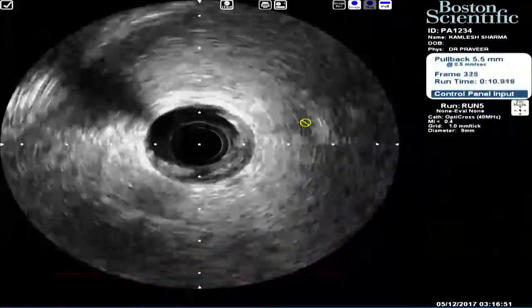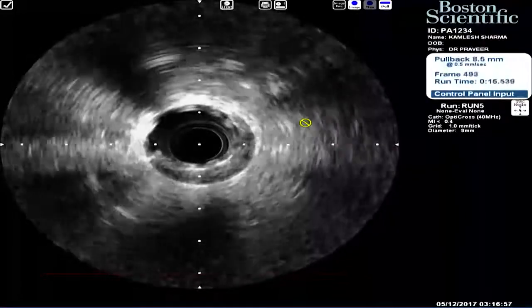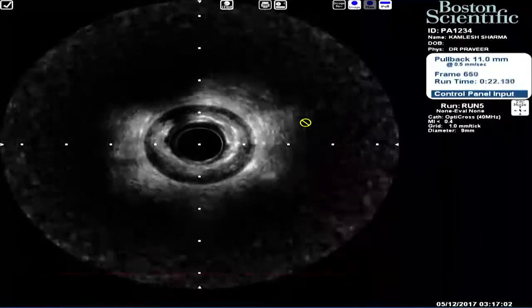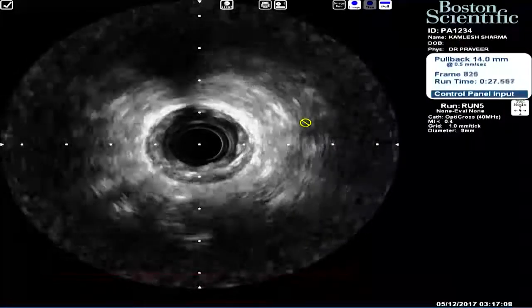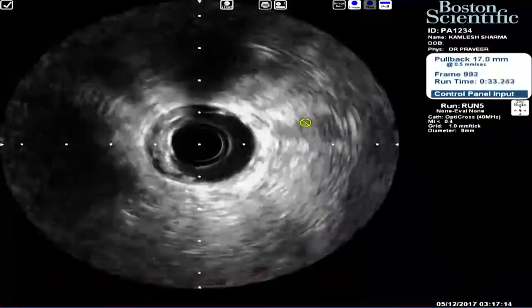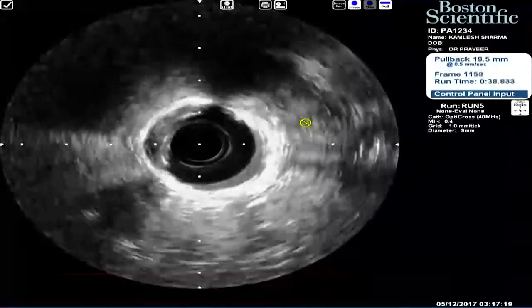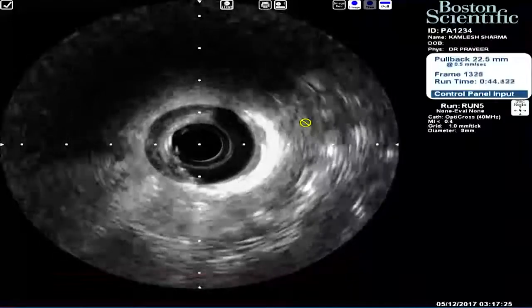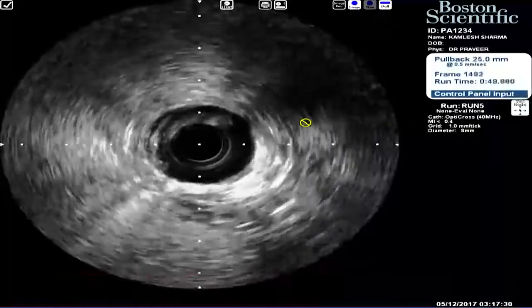Just have a look at the IVUS, please. And the ones that are not able to be expanded, we will sometimes, as a last resort, use laser. You see the same area of fibrosis still persisting. But the proximal stent is well expanded now, but that area remains the same. So there's no gap. It's just underexpanded. I haven't found laser to be actually very useful. I think it's only used in calcific cases after stenting. It's not used for anything else.